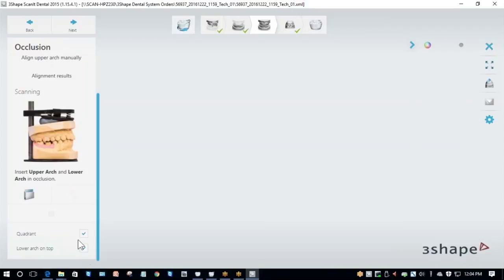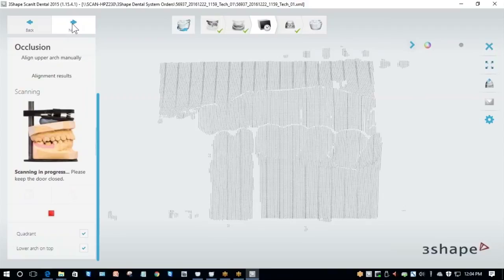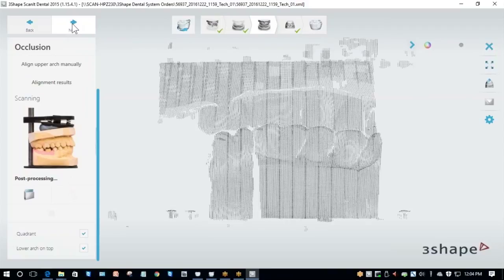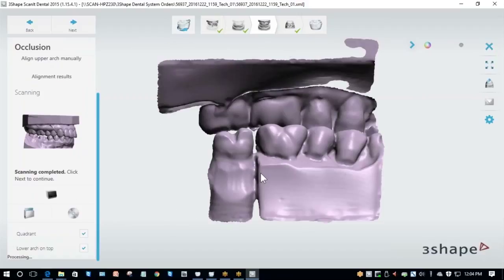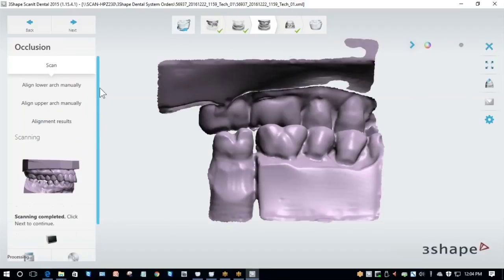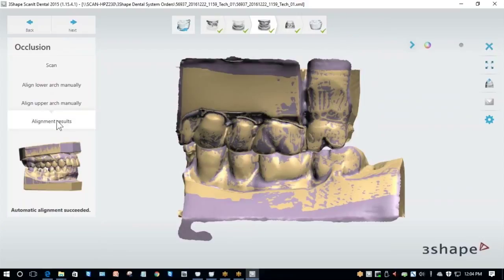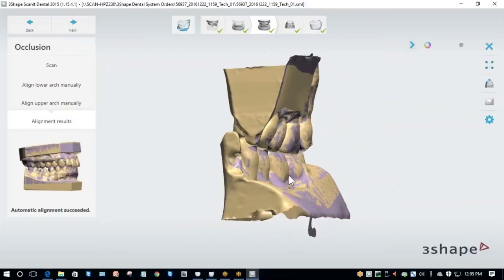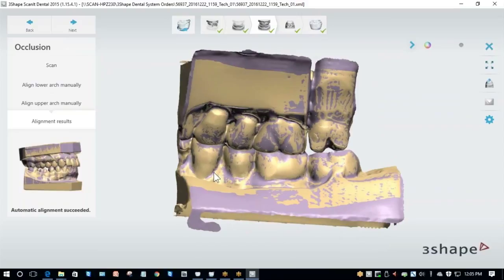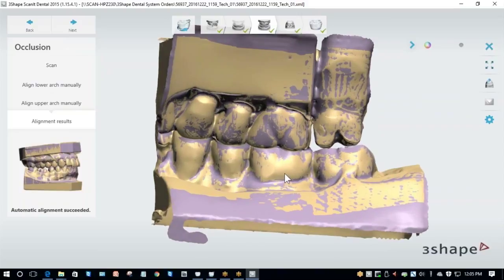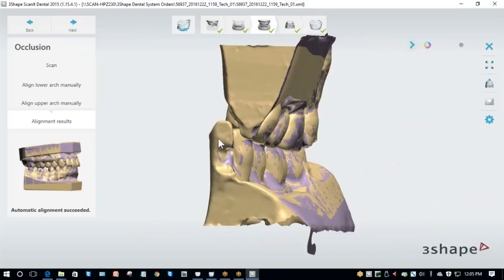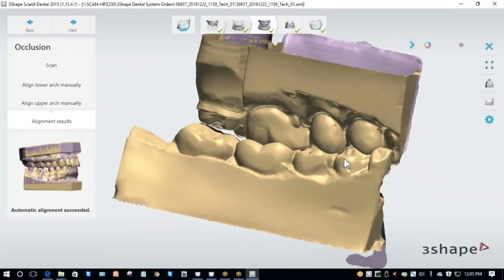Once I place my model back in the scanner, I close the door and hit Next. The scan it does here is a very quick scan. It's not intended to be in detail, it's intended to be good enough so that we can align our two previous scans to each other to have an accurate bite. Now that it's finished scanning, it's going to process and I've got several options. I'm going to click on alignment results. As you can see, it was able to successfully align my two models to the opposing scan and my bite looks okay.